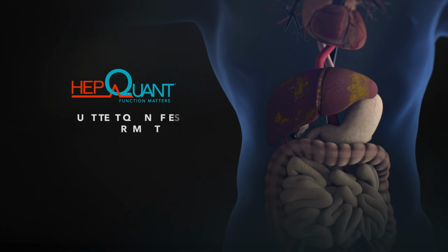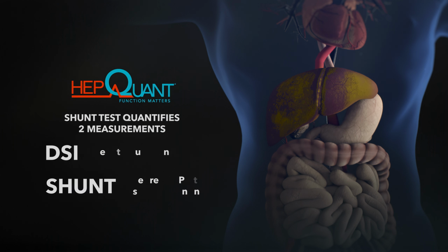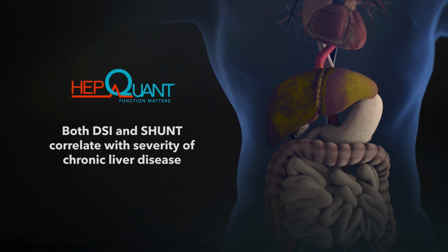To summarize, there are 2 very unique and important measurements that are quantified in the HepQuant SHUNT test: DSI and SHUNT. DSI quantifies hepatic function, and SHUNT quantifies the degree of portal systemic shunting. Both DSI and SHUNT correlate with the severity of chronic liver disease.